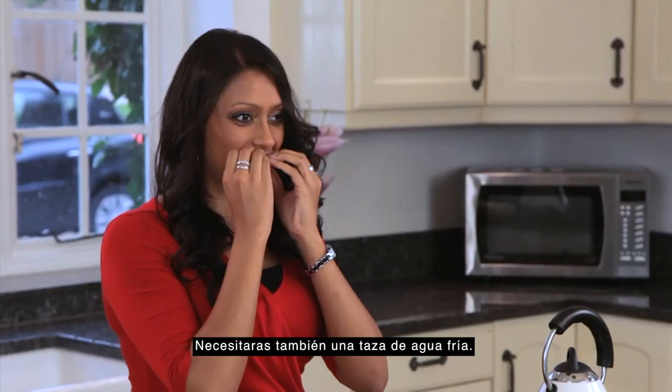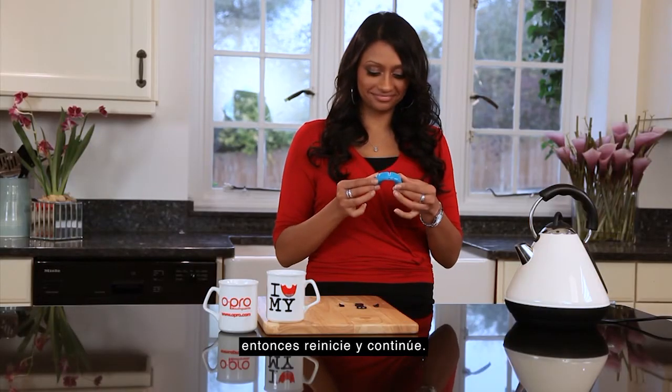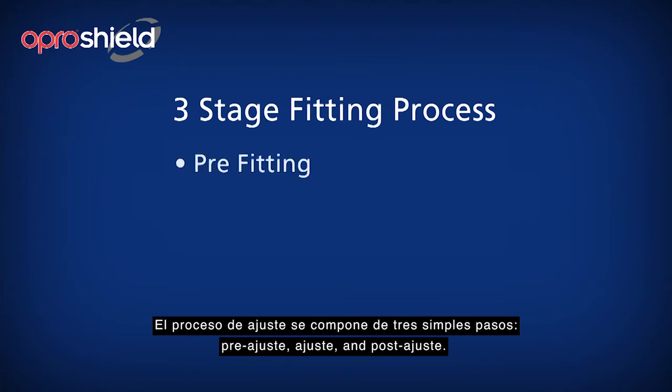It is best that you watch this section through to the end to see what is involved, then restart it and follow along. The fitting process is comprised of three simple stages: pre-fitting, fitting, and post-fitting.